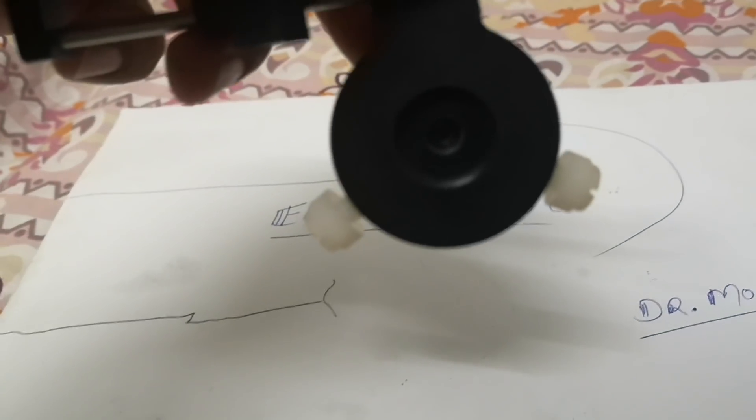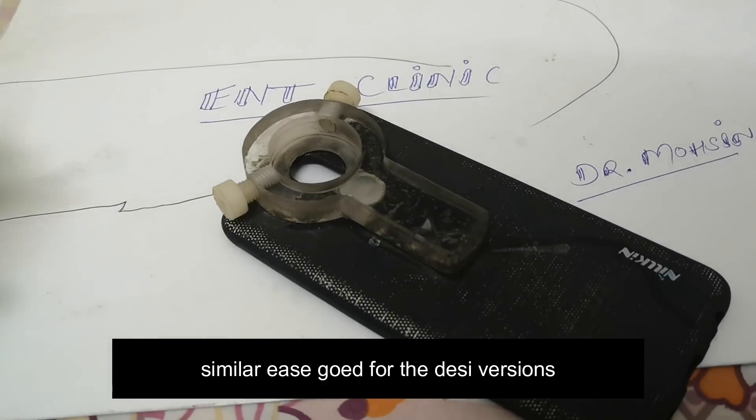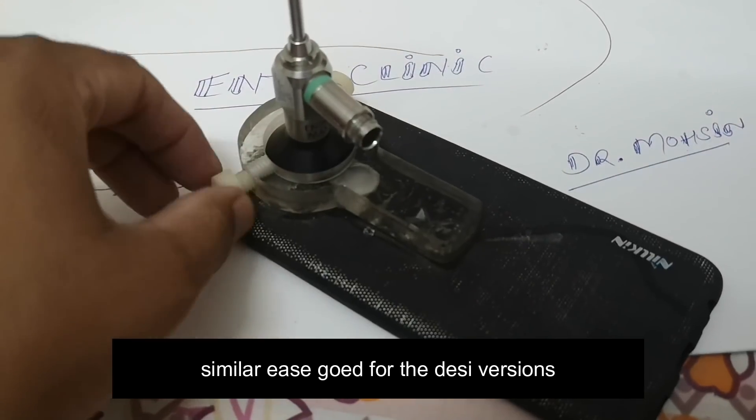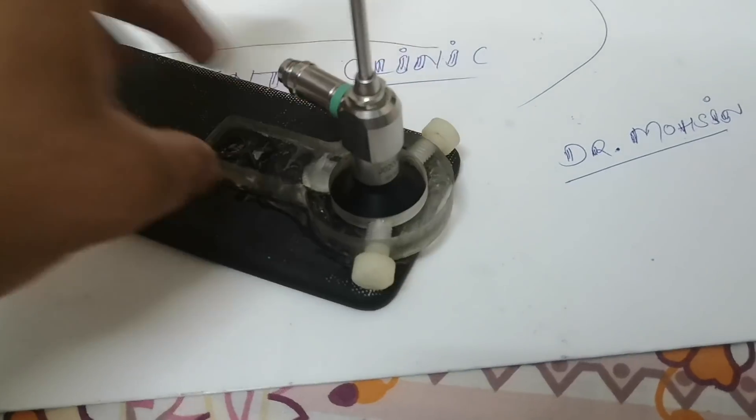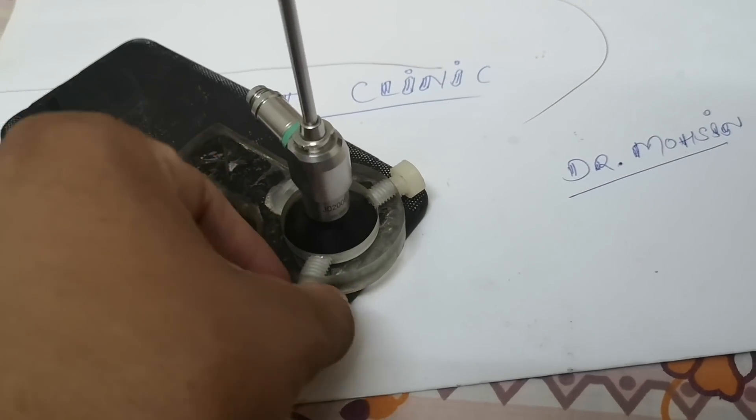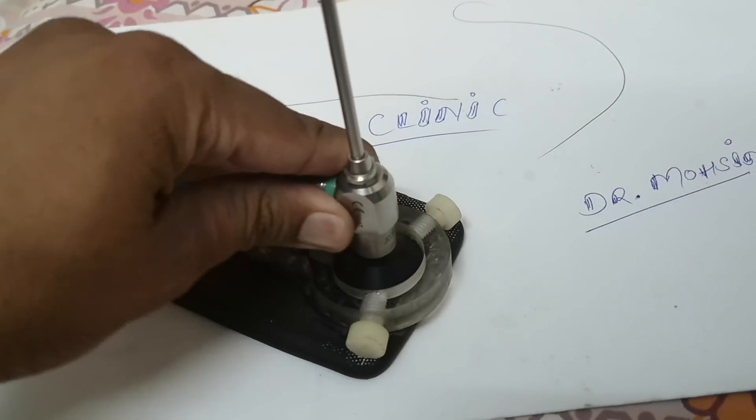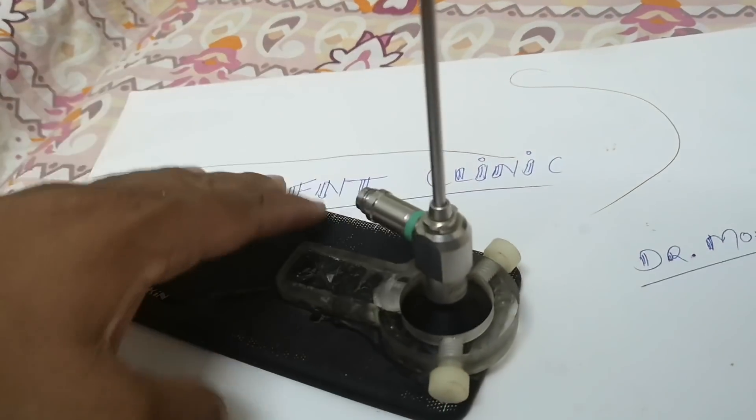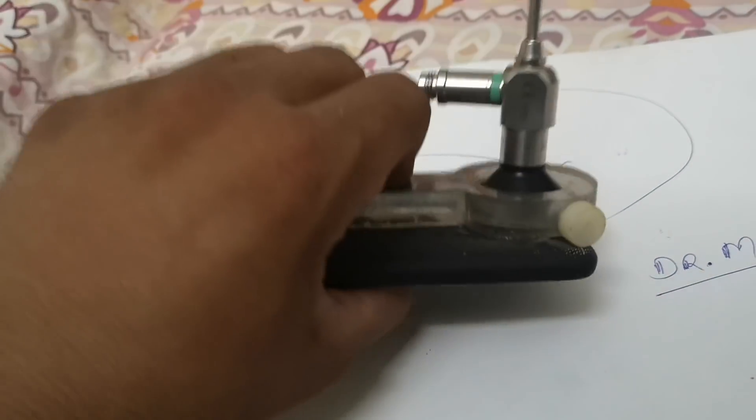Similarly you can use it. Similar ease goes for the desi version but you have to put in the measurements so well. I have been using this one most of the time. I use the Huawei Mate 10 Lite to film the ears. You can fix it in. It goes this way. It is so easy to handle it.